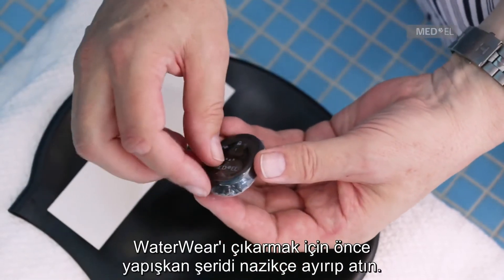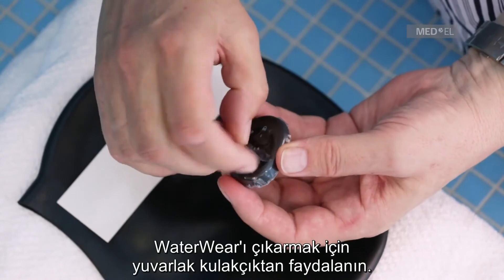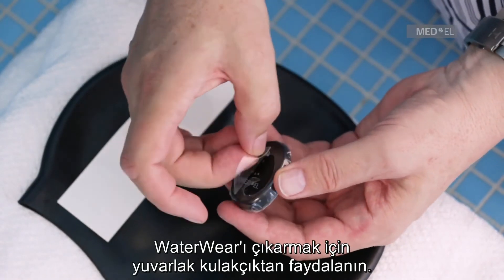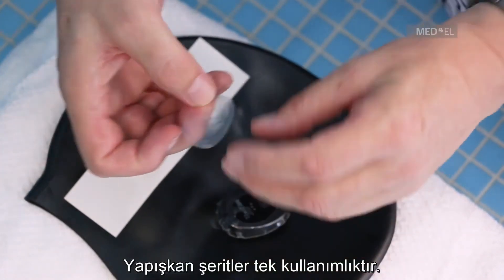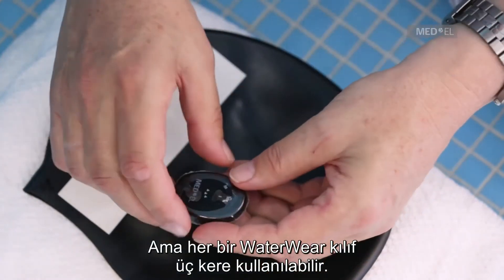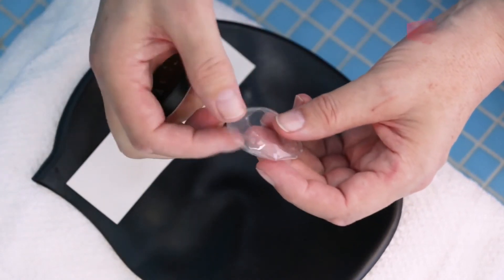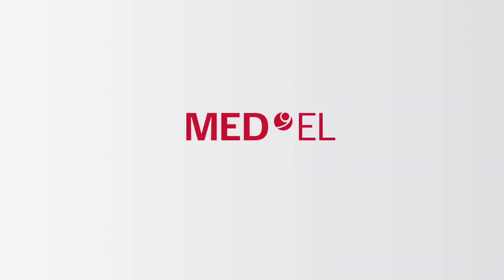To remove waterware, gently peel off the adhesive strip and discard. Use the circular flap to remove the cover from the processor. Each adhesive strip can be used only once, but each waterware cover can be used up to three times.